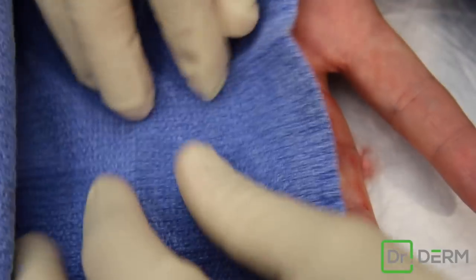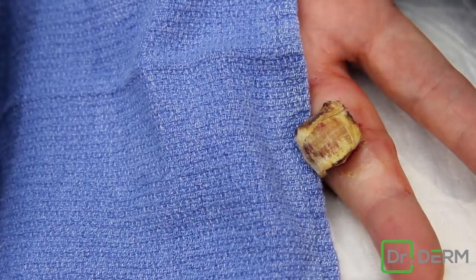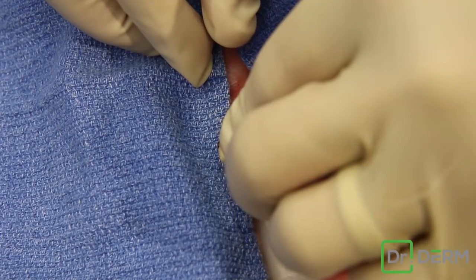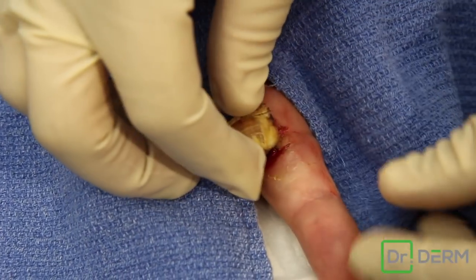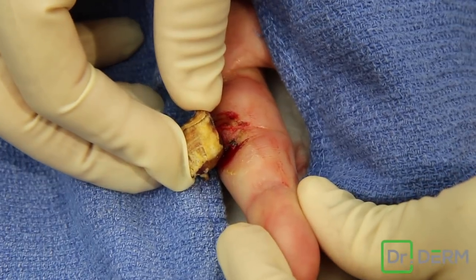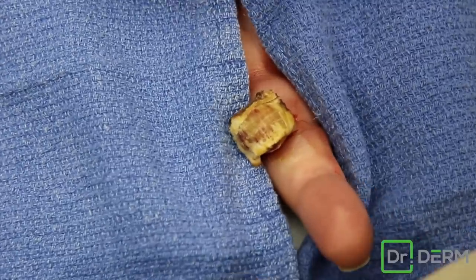This is a pyogenic granuloma. It is a vascular neoplasm. These grow really quick and they bleed like crazy. The typical way we take these off — these are pedunculated lesions, which means they have a narrow base. We take these off, we usually cauterize the base, and I'd say 85-90% of the time they do not come back.